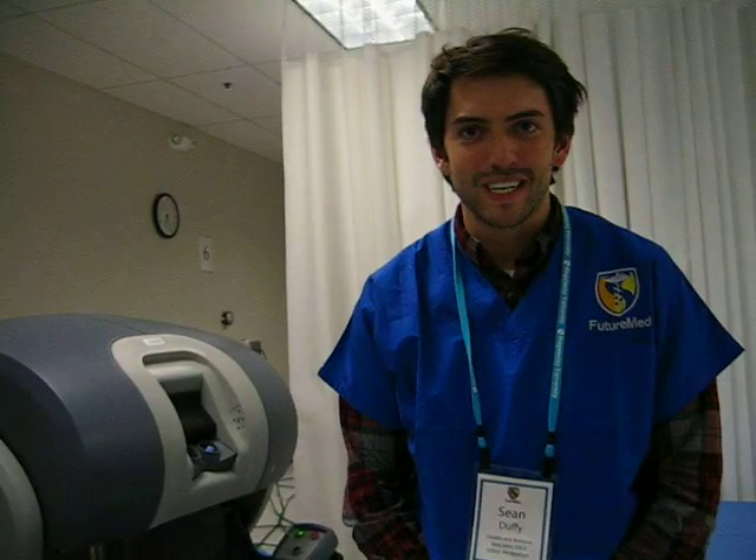Hi, Sean Duffy with MedGadget. I'm here at Singularity University's Future Med, at the Intuitive Headquarters playing with some DaVinci robots.